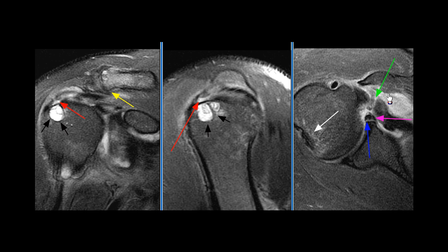A complete tear of the subscapularis tendon is demonstrated with retraction. There is moderate arthrosis of the acromioclavicular joint.